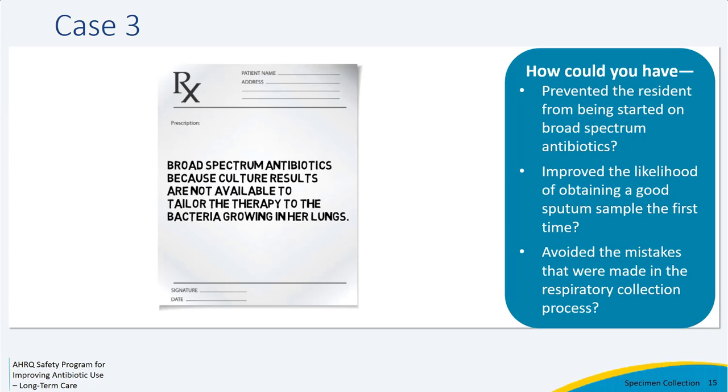Sometimes it helps to explain to the resident that you are trying to obtain a specimen deep from their lungs so they understand you do not want them to just spit in the cup. The specimen should be collected directly into the sterile container. Transferring it from a non-sterile cup defeats the purpose and can risk contamination. Finally, the specimen should not sit around after collection. It should be sent to the lab as soon as possible.